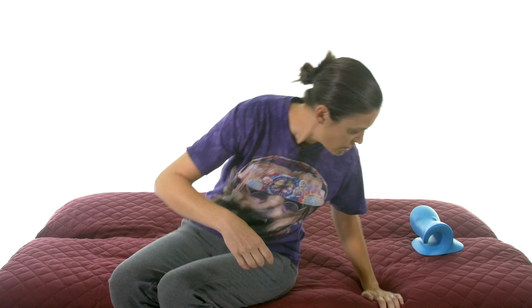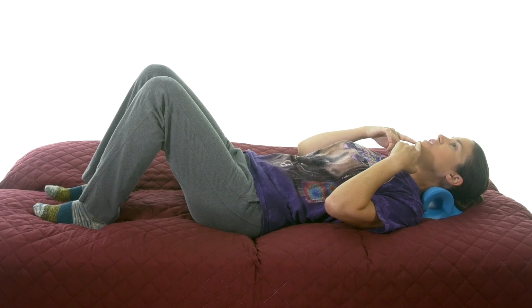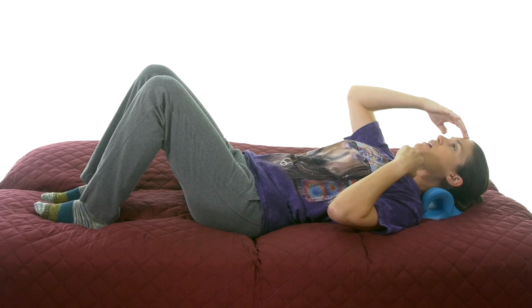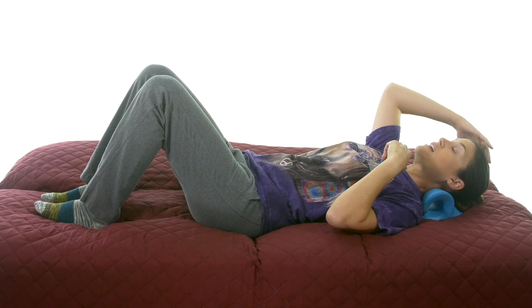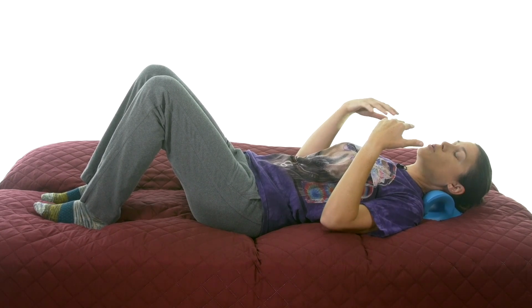So the best way to do it is when you lie down, have your knees bent up, and that just takes pressure off your lower spine as well. So you're just going to lie down. You want that curve to go right into the curve of your neck, but my chin is in a neutral position. My forehead shouldn't go further down, so you don't want a big, huge curve. You just want it taking that pressure off of it.